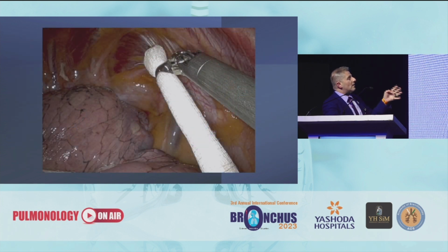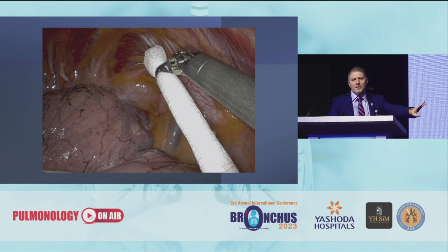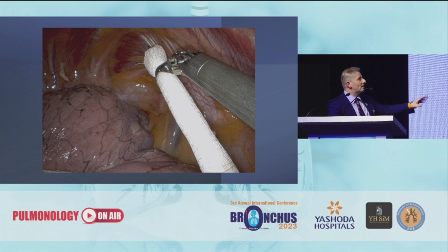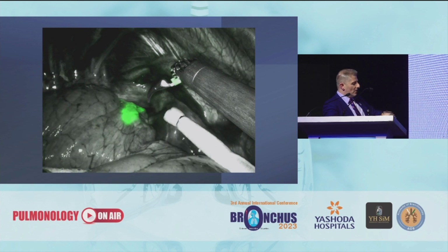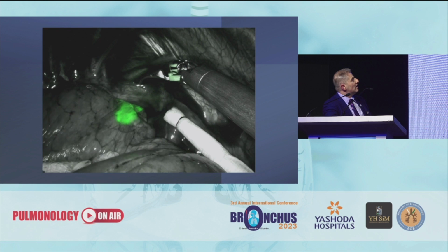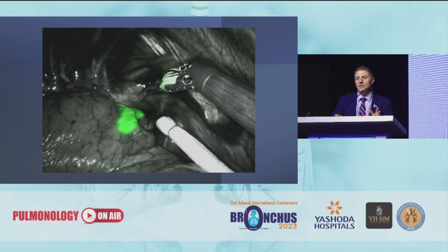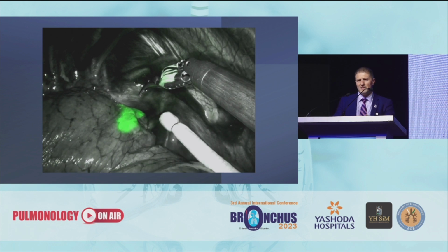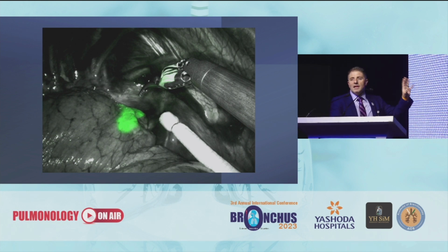Now, after turning the patient, the Xi is in, the ion left the room, the O-arm left the room, and the surgery started. With the Xi changing the light wave, you can see very clearly that the lesion is very well labeled, so the surgeon doesn't need to fish for where it is, like in the past, trying to get a feeling or see if the signal is there. This lesion really gave us the best signal when starting these cases.